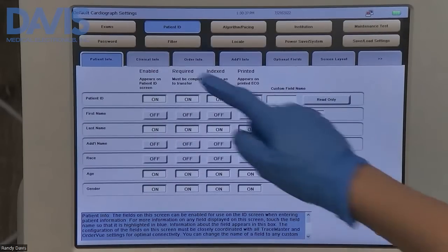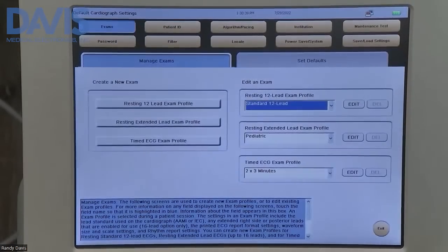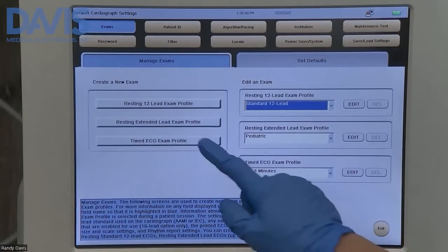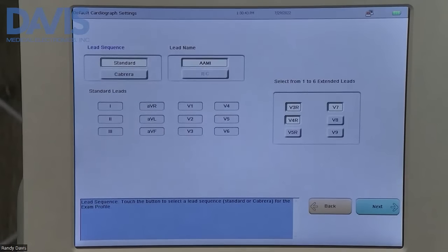From this page, you're going to hit exams, then click on resting extended lead exam profile.